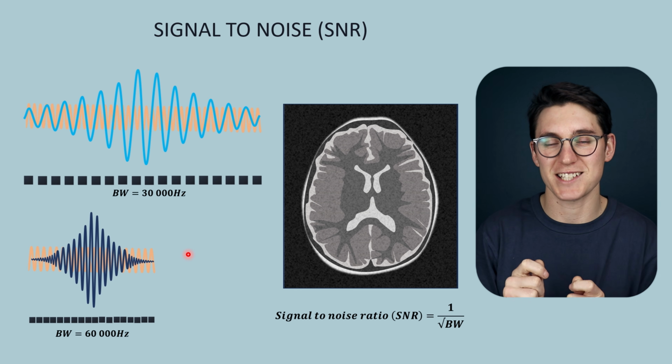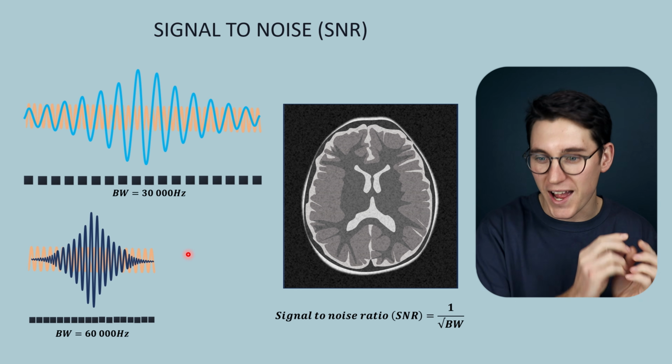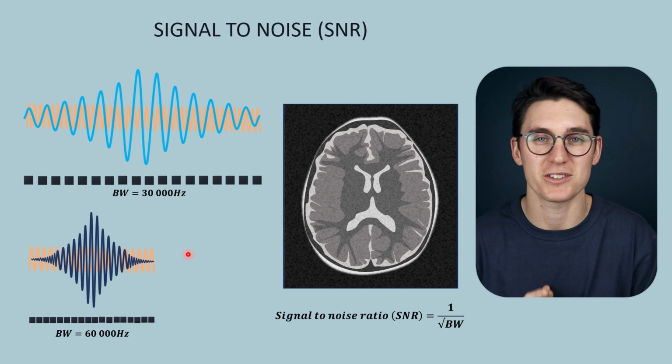Now we're going to move on to the section that many of you have been waiting for, and that is going through the individual pulse sequences.